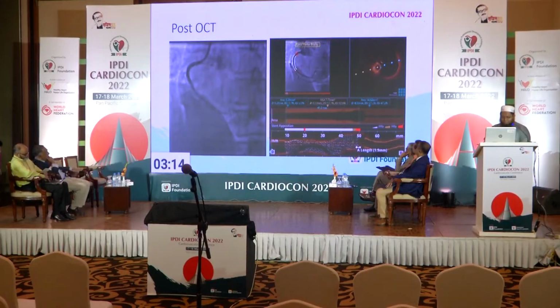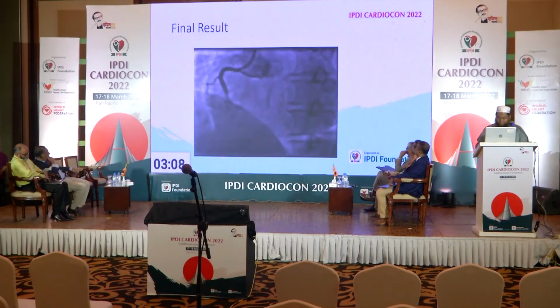After that, we checked the OCT again, and found the stent nicely apposed, with no longitudinal mismatch and no malapposition. This is the final result.